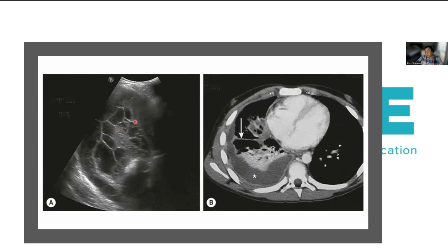I think the most important aspect for me when it comes to chronic effusions, especially effusions where they've previously had drains, and a good example is babies who have chylothoraces, often who might have drains right from the start, or exudative pleural effusions where they've had infective changes. Well, these effusions can be septate, and an X-ray might not be able to delineate that as well. An ultrasound would, which means that if you want to do, again, diagnostic or therapeutic paracentesis, you can choose the area that you might want to.